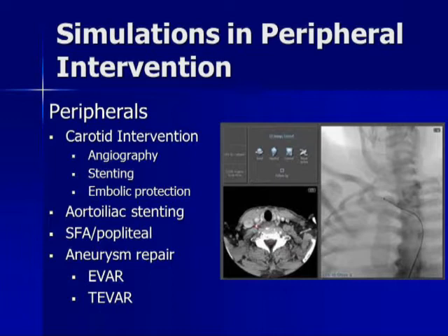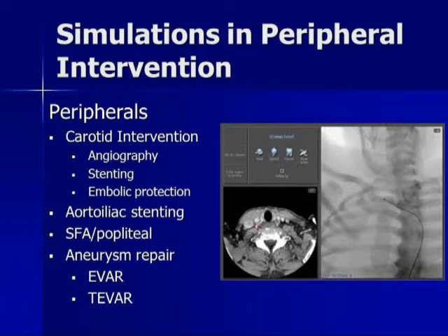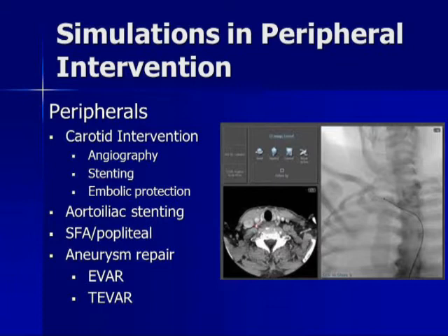So whether you're a vascular surgical resident or attending, a neurointerventionalist, a cardiologist, or a cardiothoracic surgeon, everyone is learning the same basic access, wiring techniques, balloon, catheter equipment selection techniques using simulation. And nowadays this involves high-risk things like carotid stenting. Carotid stenting, by FDA requirements, requires simulation training for you to actually become certified to be an interventionalist doing carotid interventions, and that was the first FDA approval ever that required simulation training.